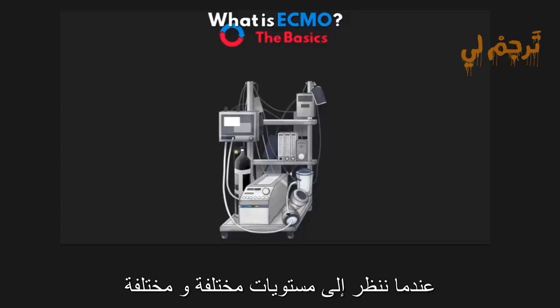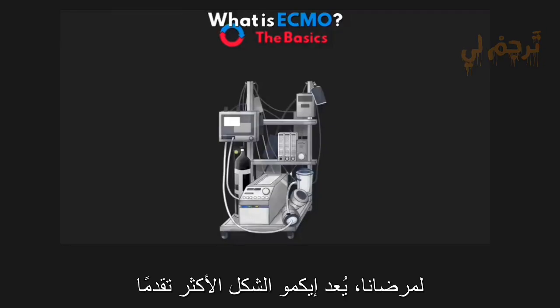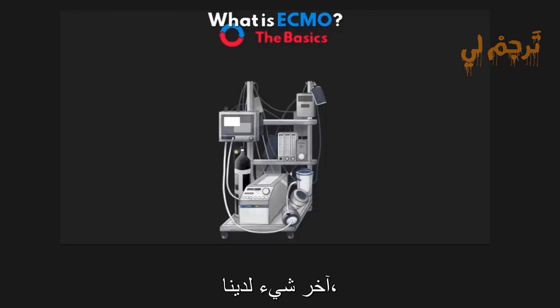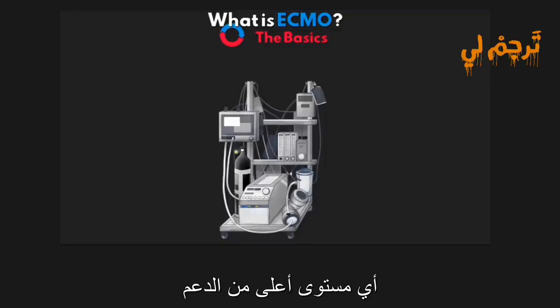When we look at different varying levels of life support that we can offer to our patients, ECMO is the most advanced form. Essentially, when all others have failed, ECMO is the last thing that we have left. And if ECMO is not enough, then we really don't have any higher level of support to offer our patients.